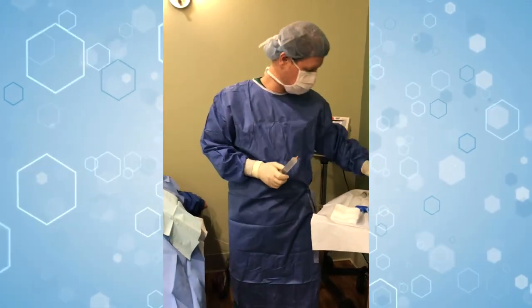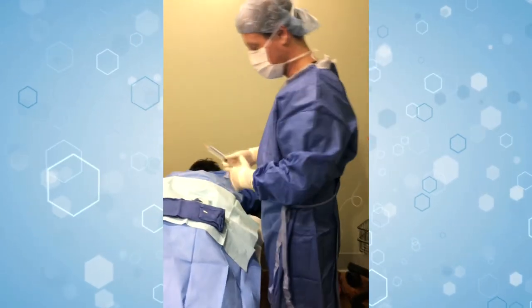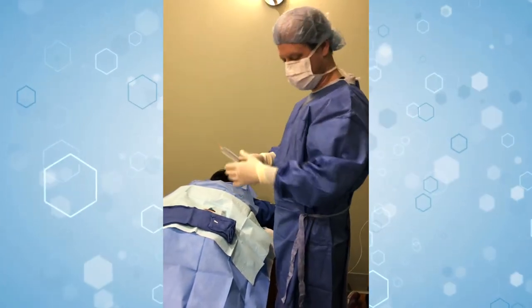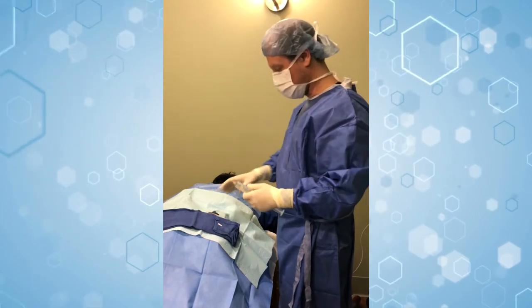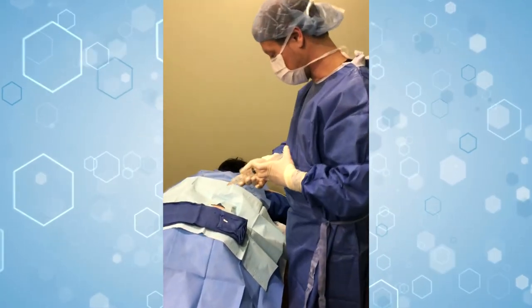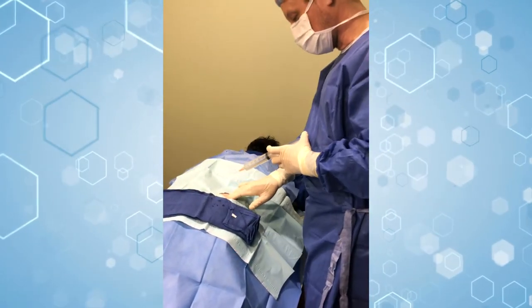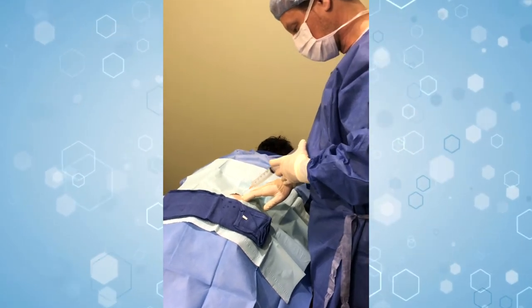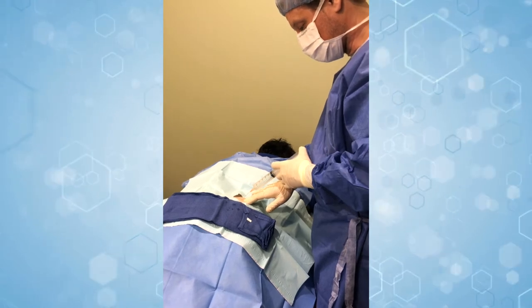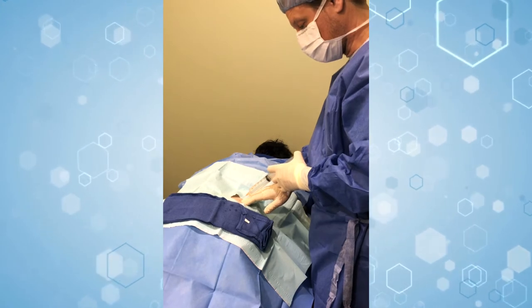The first thing we're going to do is some numbing of the skin. So I have a towel here and you can see that we do a full surgical prep — that's a little bit above and beyond what most people do. We try to go above and beyond to make sure everything's done safely and correctly. So we're going to identify what's called the posterior superior iliac spine right here. I'm just going to make a little stick here. And I know this syringe looks huge, but it's just because we want to put a lot of numbing in there so she's extremely comfortable during the entire procedure.